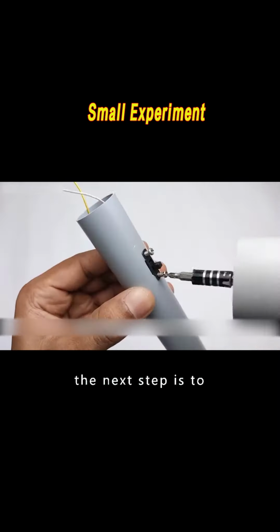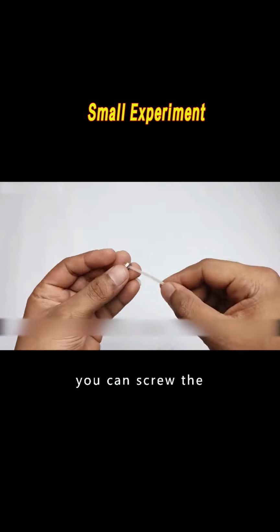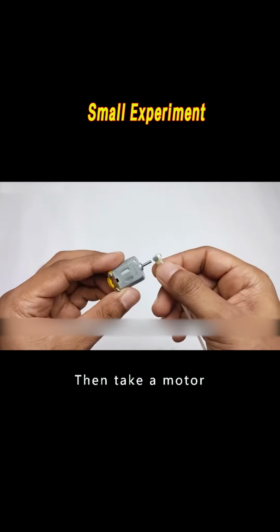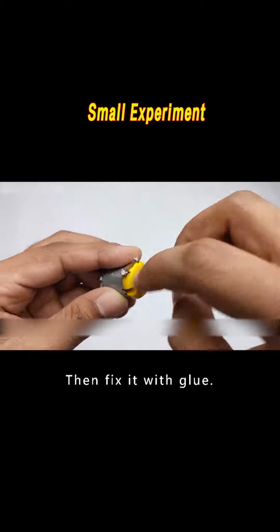Once installed, the next step is to attach the switch to it. After soldering the wire, you can screw the switch to the handle. Then take a motor and a small nut and tie the nut to the shaft of the motor with a tie. Then fix it with glue.